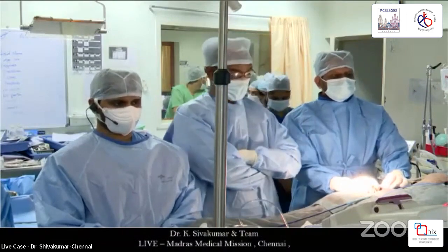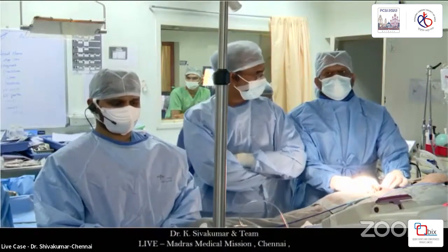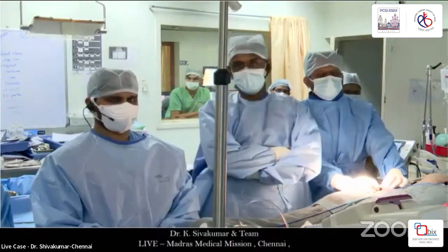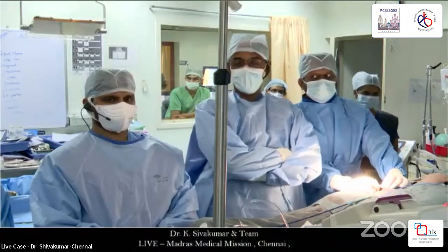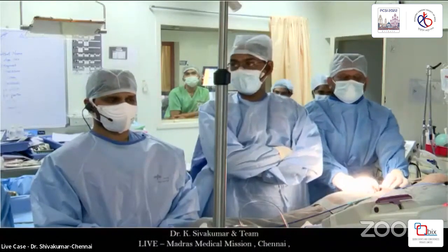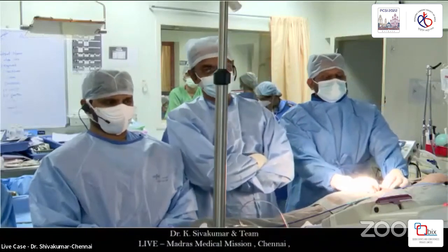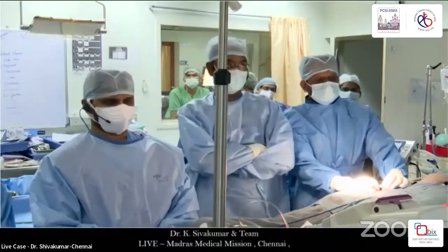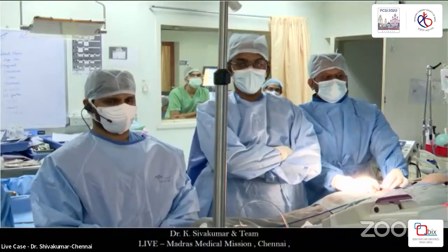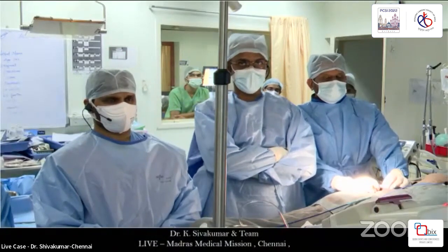So we have here my team: Dr. Vishnu, Dr. Pramod Sagar, and Sister Janaranjani. Among the radiographers, we have Prabhu and Surya. Selvakumar is our intensivist monitoring the patient's anesthesia. The patient is on general anesthesia. I request Anand Kumar, one of my colleagues, to give the brief clinical presentation.